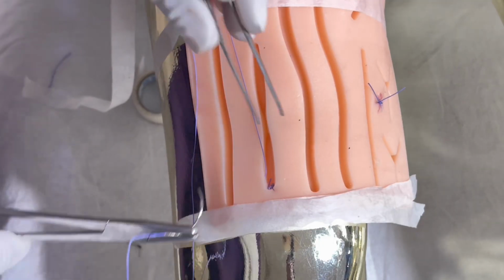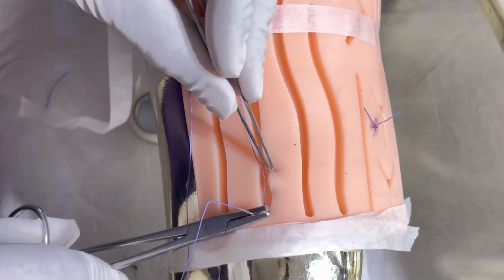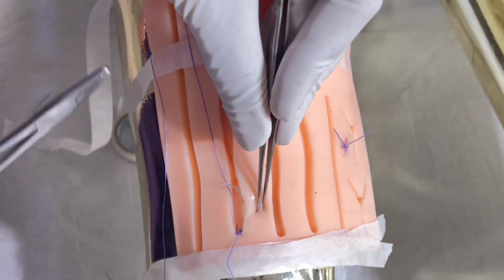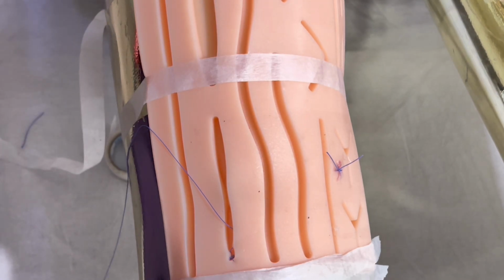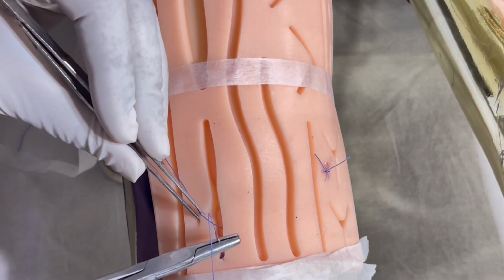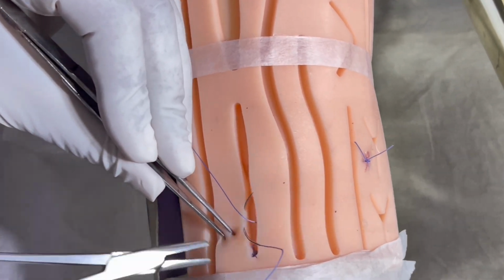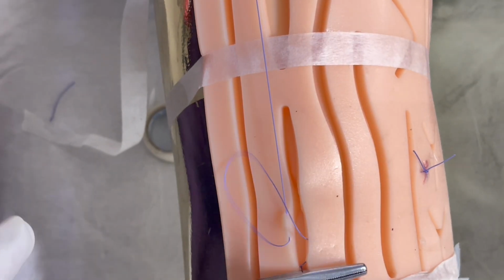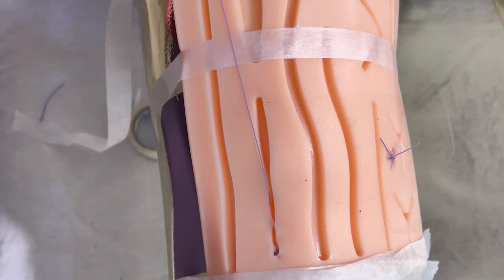This has to be continuously sutured. Take these stitches continuously in an S-shaped manner. So the skin is getting approximated.